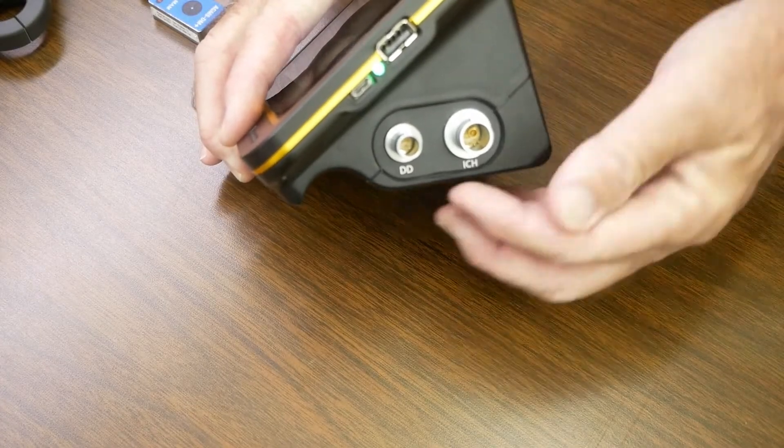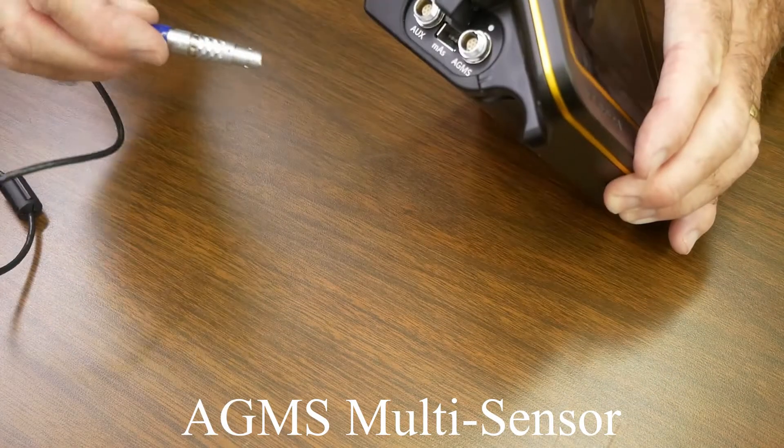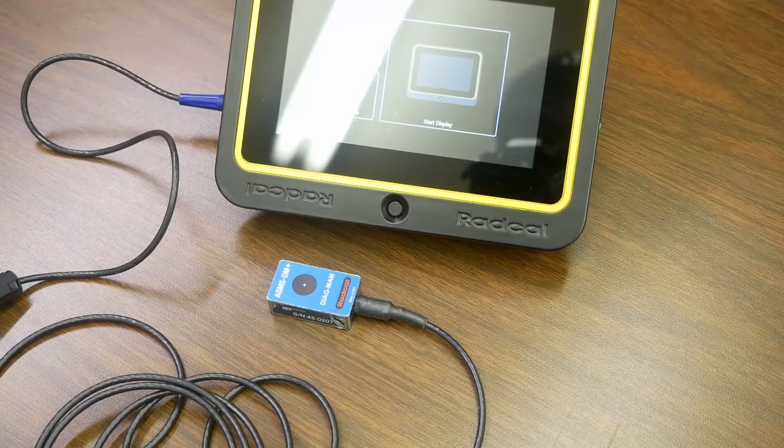There are orientation dots above the connectors that indicate proper alignment with the mating connections. The multi-sensor can be pushed into the mating connector with ease. Align the connector dots then insert. To release, pull back on the connector shell then remove the sensor.